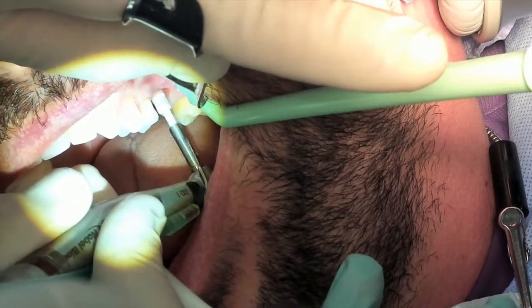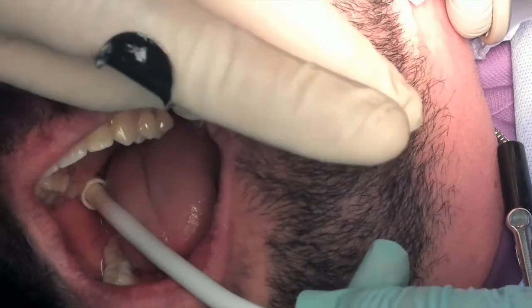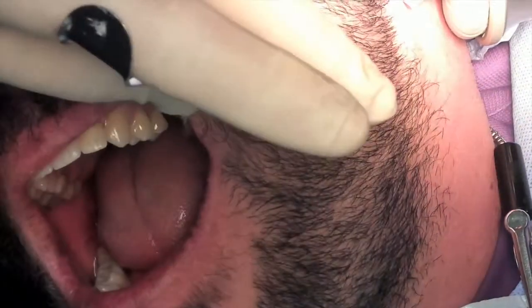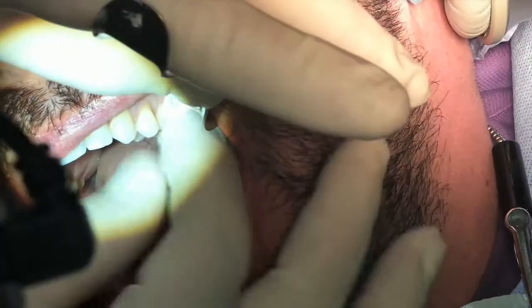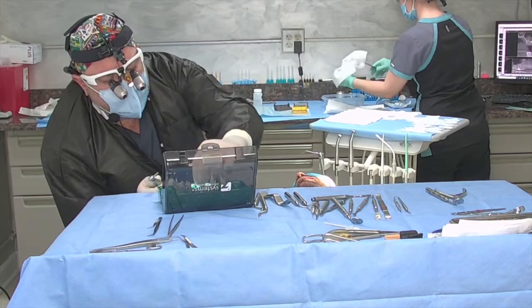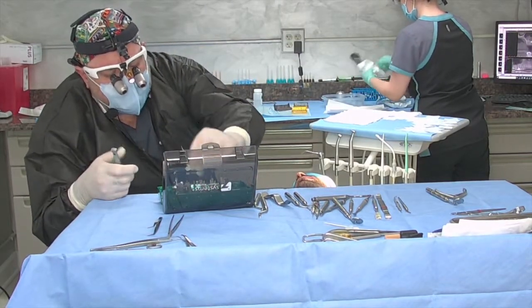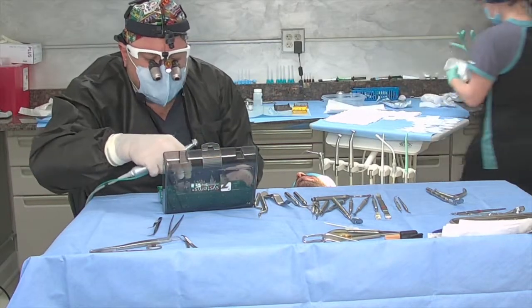We're right at 8 again. Definitive stop right at 10. And if you look at here... If I could have that. And while you're doing that, go ahead. I'm going to switch this over to here, and I'm going to put this on. So what I'm doing is I'm going to the tap because Matt's bone is pretty sturdy here.